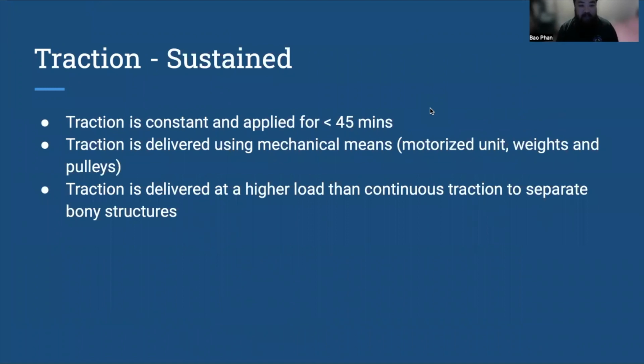Next, we have sustained. This is going to be constant traction that's applied for less than 45 minutes. Again, it's going to be delivered by mechanical means, so think motorized units, weights and pulleys, and it's going to be a higher load than continuous traction. The goal of it is to separate the bony structures.